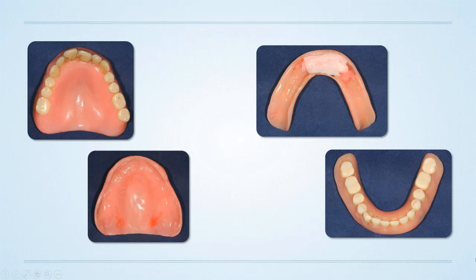To me, this is a prime opportunity for us to start talking and engaging with our patients about implant overdenture treatment. And this patient, even though he came in for a limited fix, I said, hey, what's going on with all this stuff that you've got here in this lower denture? He says, well, doc, it's a lower denture. I says, no, I don't know. Tell me why you're doing that. Oh, well, I need to put that in there so that way my teeth don't flop around on me.